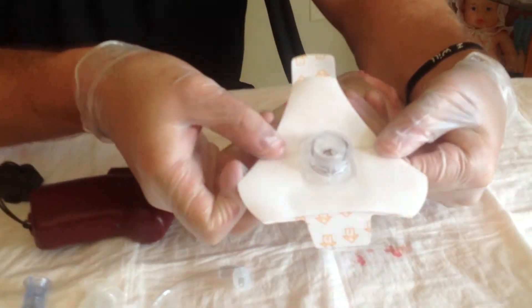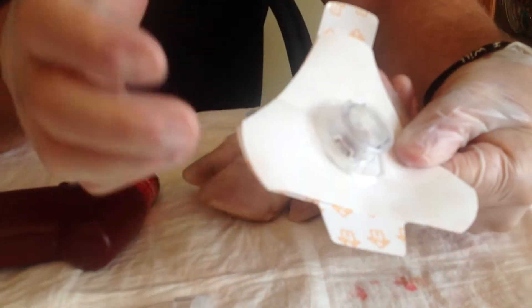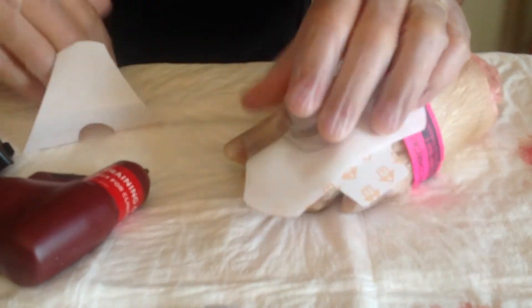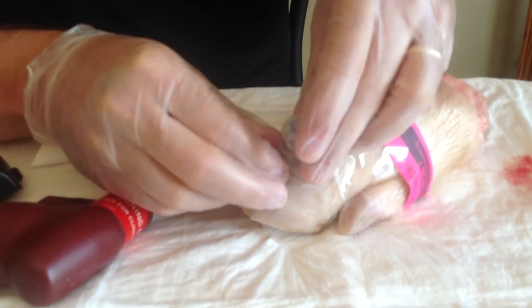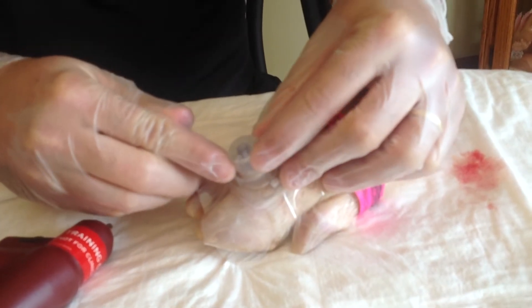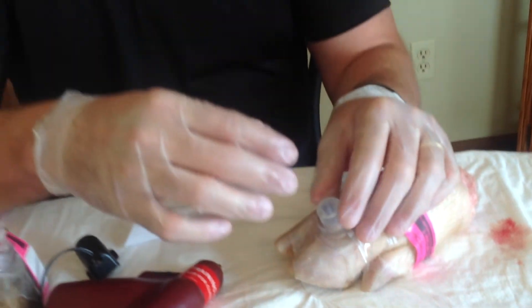The other cool part when you play with the stabilizer is if you notice right here — if I put my finger on the inside, you see how this little plastic piece can pop up and down. That's important when we go ahead and place it onto the site. Once it's in place, I pull one, pull two. What's important is that if we have some swelling of the skin — let's say in a burn or trauma situation — this part right here can raise up or go down a little bit. As it rises up or goes down, if we have a little bit of swelling, it actually allows the dressing to lift up, but it doesn't put pressure on the needle, meaning it's not going to remove from the bone.